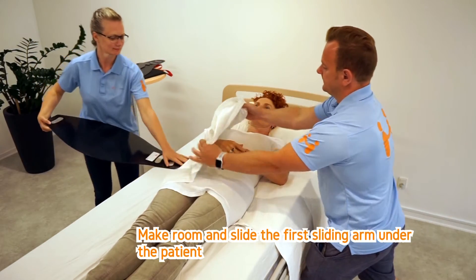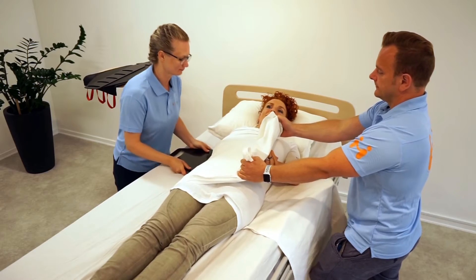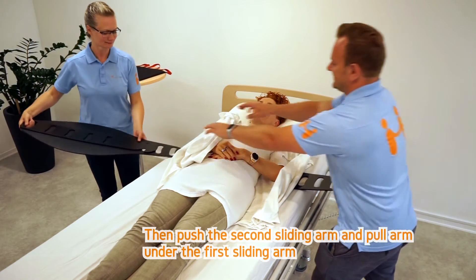Make room and slide the first sliding arm under the patient. Then push the second sliding arm and pull arm under the first sliding arm.